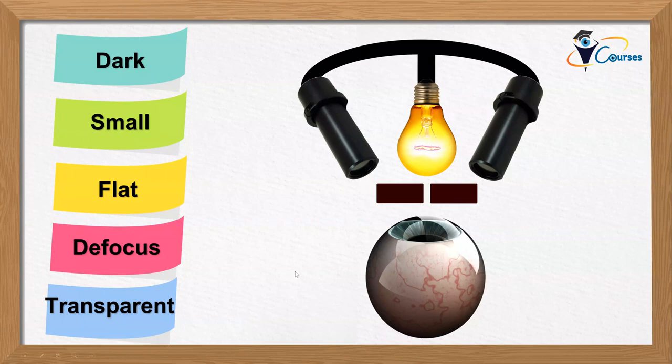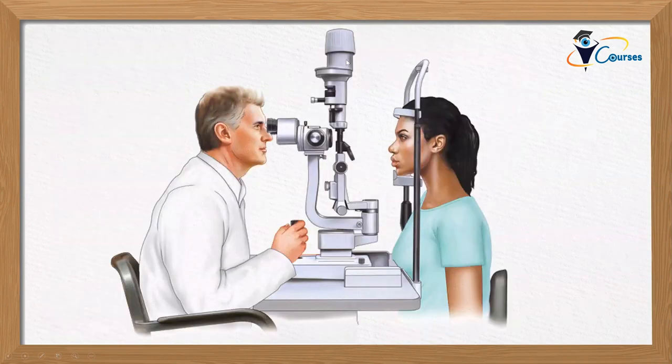Okay, so this is just a quick brainstorming where we are inventing the slit lamp by mounting a light source and a microscope together on a mechanical system that makes the focus at the same time on the eye, with illumination and observation from binocular microscopes, so that the focus of the light will always be the same as the focus of the microscope.